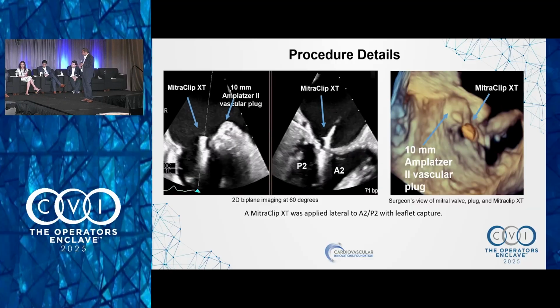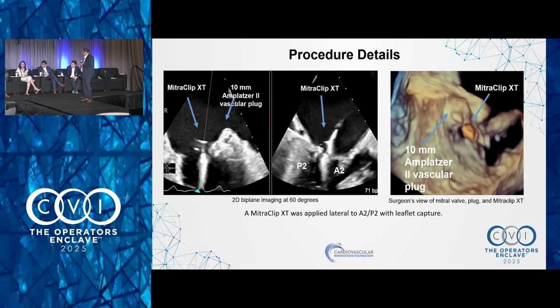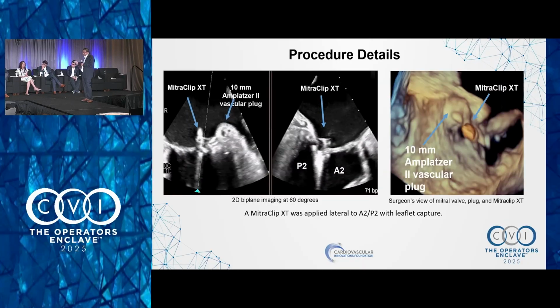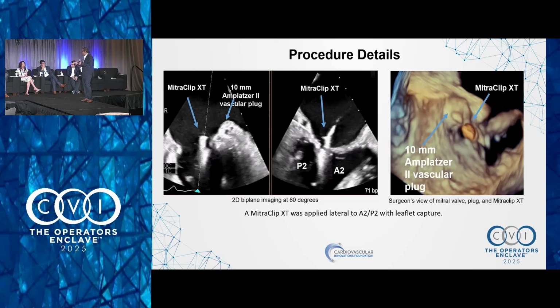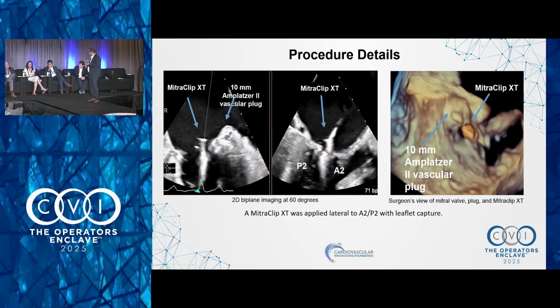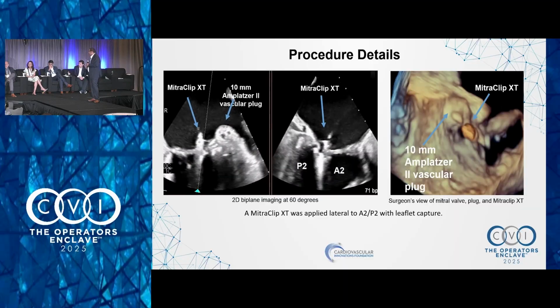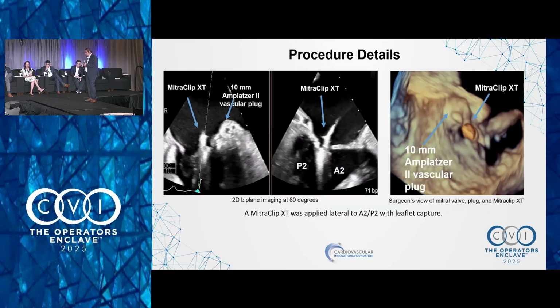I would have said clip first, in case you can't see the leaflets for grasping, or the plug interferes with the leaflets for grasping. The other counter argument is you put a clip in and now you're pushing and pulling in the commissure. You can rip off the leaflet from the clip. It's a fresh clip, and that has happened to me too, with plugs after clips. No one knows the right answer, but I think we felt that.